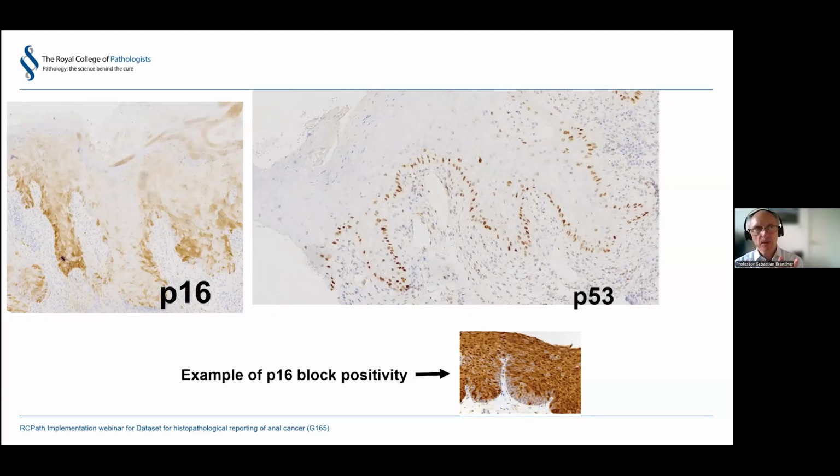Going back to the first question, is it wild type or aberrant? Mutant. It's mutant. Aberrant mutant. Yes. Okay. So the next question that we have from the audience is, do you perform the IHC on all the lichenoid lesions?